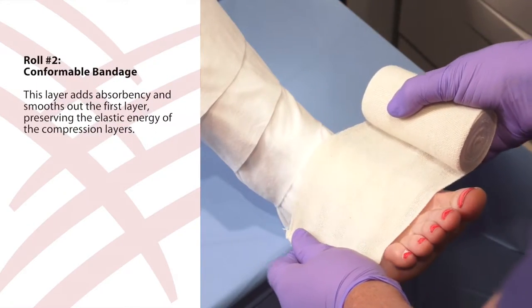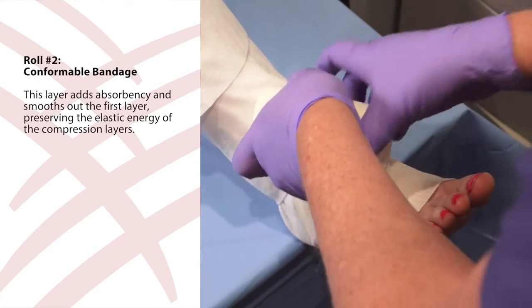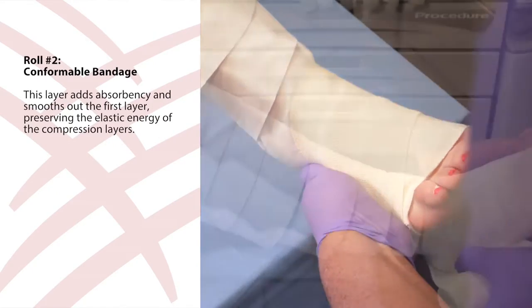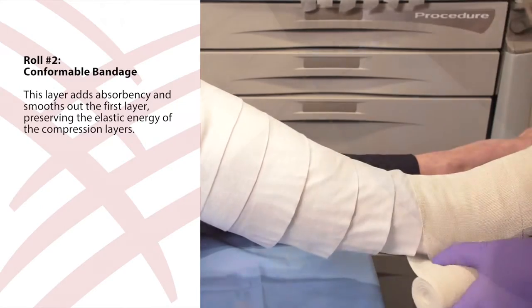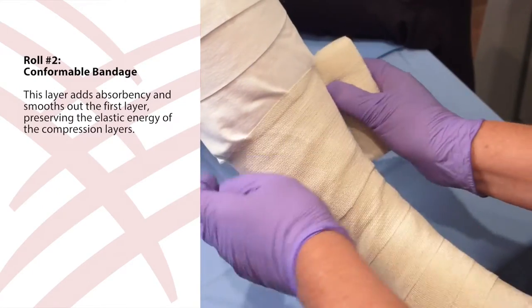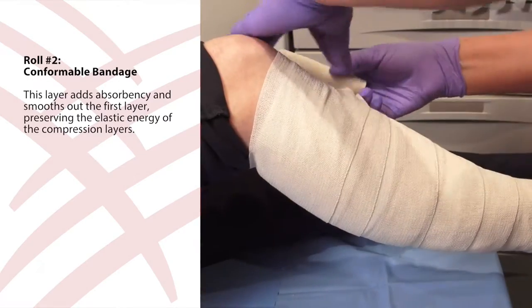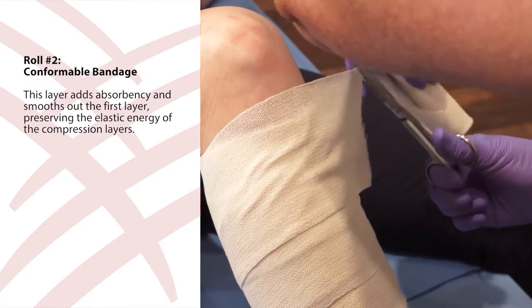Next, use roll two, the conformable bandage, and start at the base of the toes and anchor the bandage with two wraps around the foot. Then wrap the ankle, move to the front of the foot, and start to work up the leg using the spiral technique, ensuring 50% overlap. Finish by leaving a straight edge to layer one and cut any extra bandage.